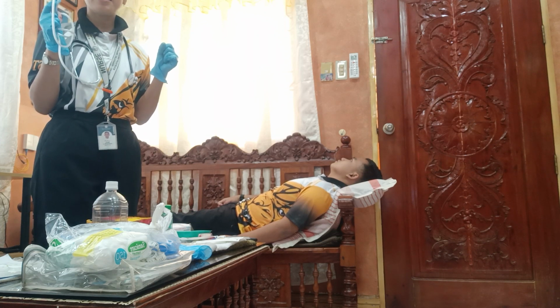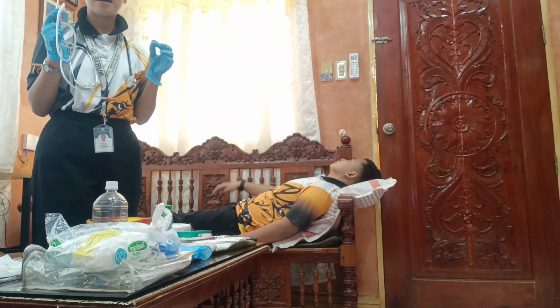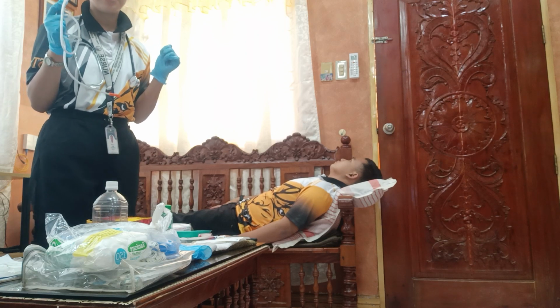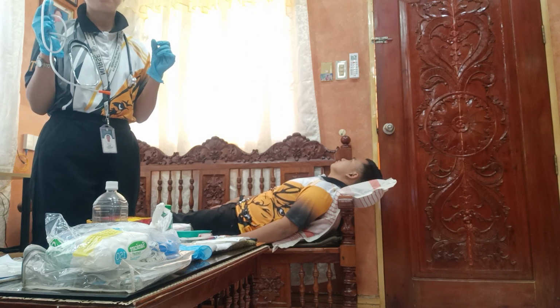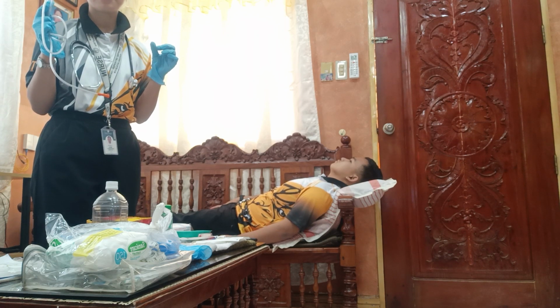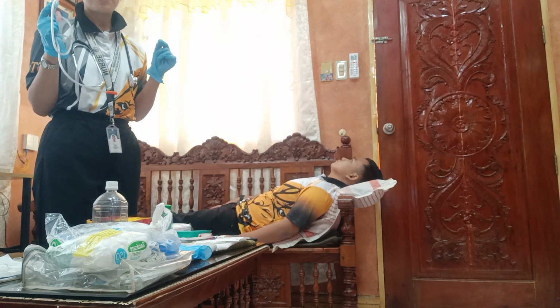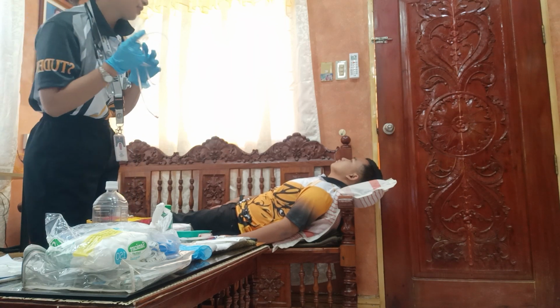So, after selecting the appropriate nostril of the patient, slightly flex the head against the pillow and gently insert the tube into the nostril while directing the tube upward and backward along the floor of the nose. And also, patients may gag when the tube reaches the pharynx, so provide tissues for tearing, watering of the eyes, and offer comfort and reassure the patient.